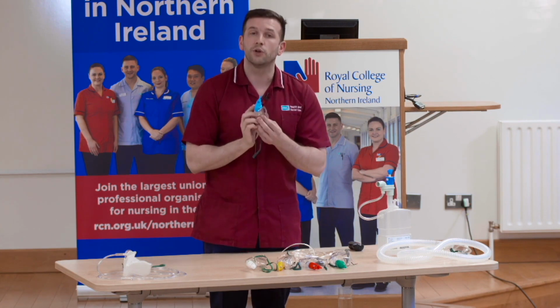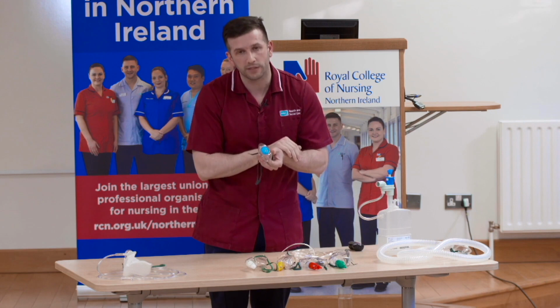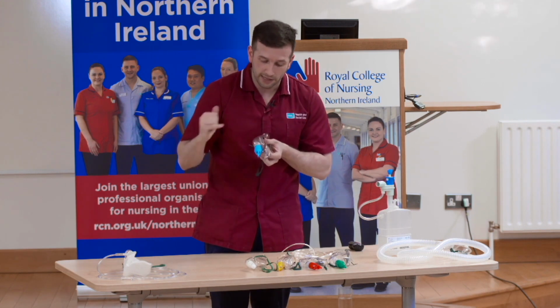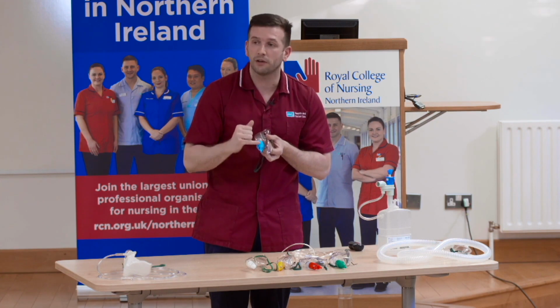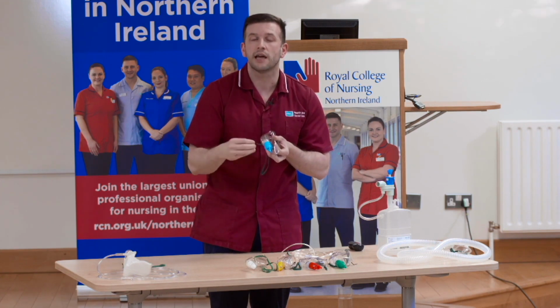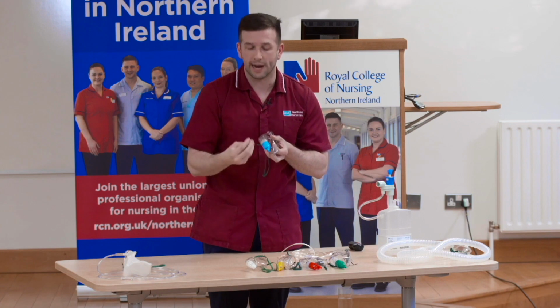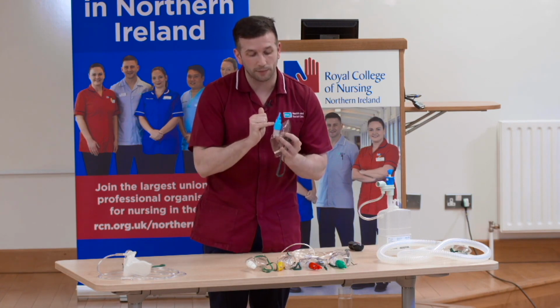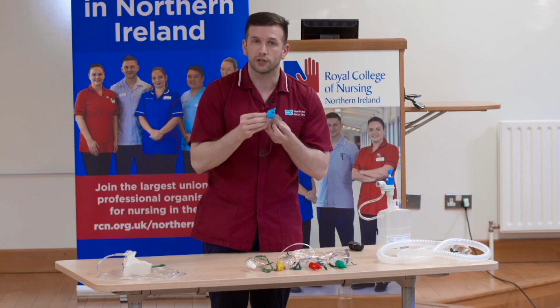We start with the blue barrel, and it's known as 24% oxygen therapy. What you may find, depending on different areas, is that it will be written on the side of the barrel how much oxygen concentration it is and the flow rate required to activate it. On this type of Venturi barrel, it's inscribed at the bottom, 24% at 2 litres per minute.